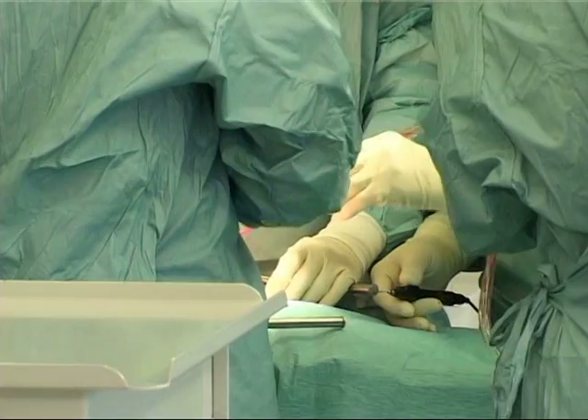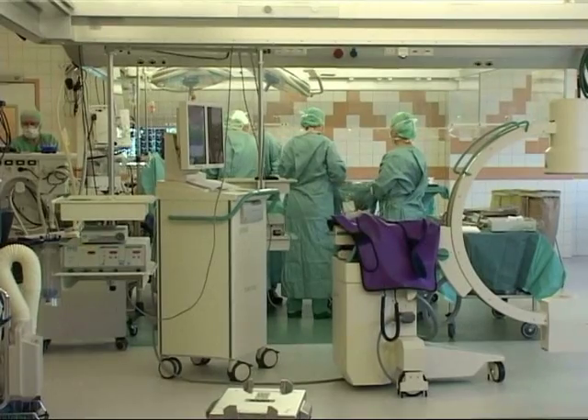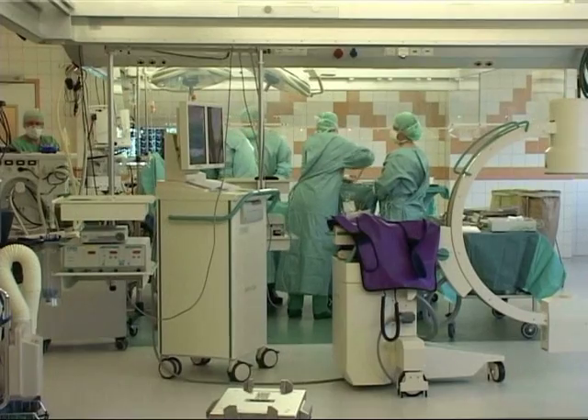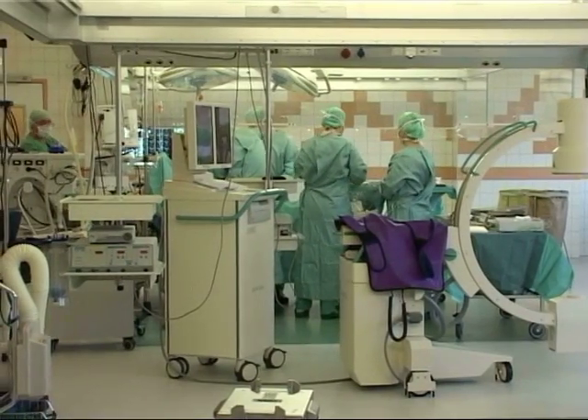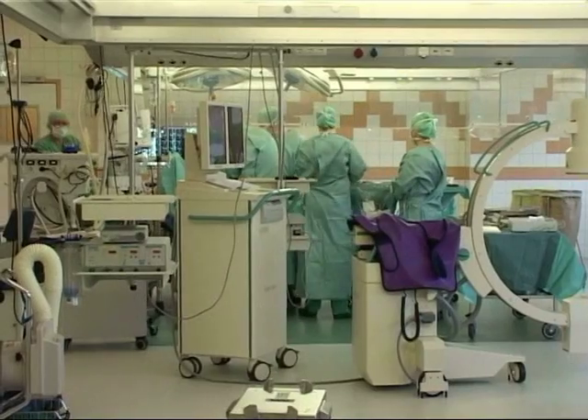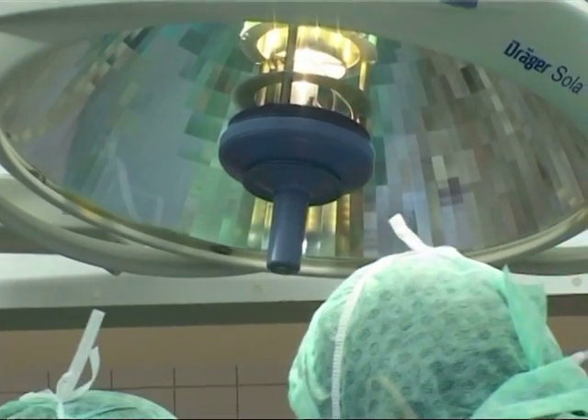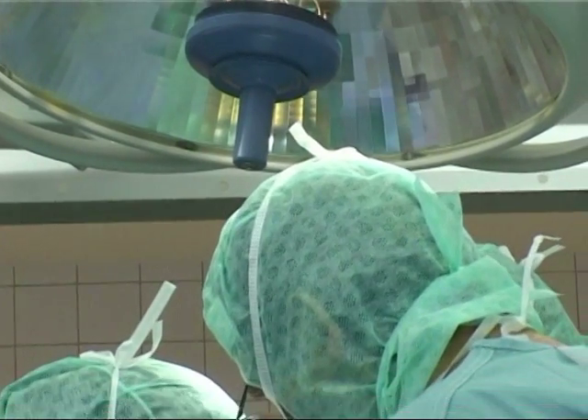This is where the big blood vessels — veins and arteries — can be found, running alongside the spine to supply blood to the legs. This is the part of the surgery that takes the longest, around 10 to 15 minutes, because we need to expose them carefully in order to locate them. We don't want to harm them on our way to the spine.